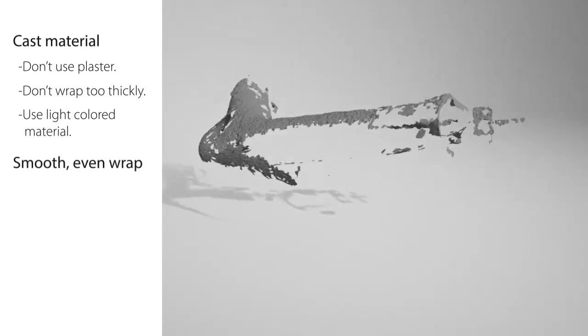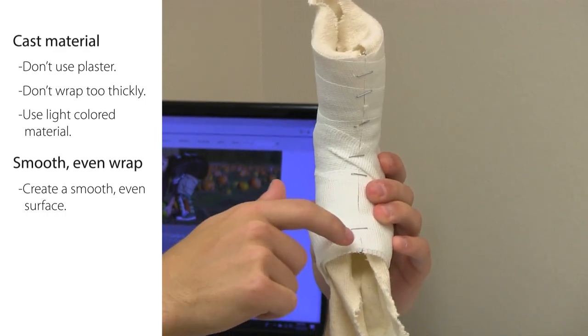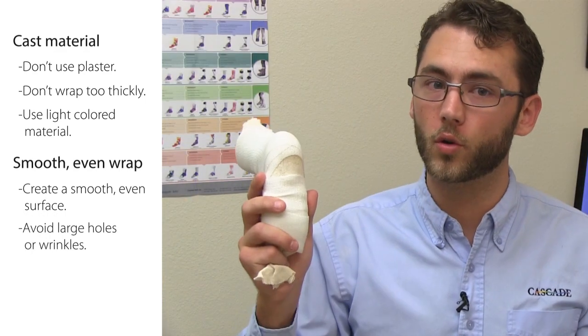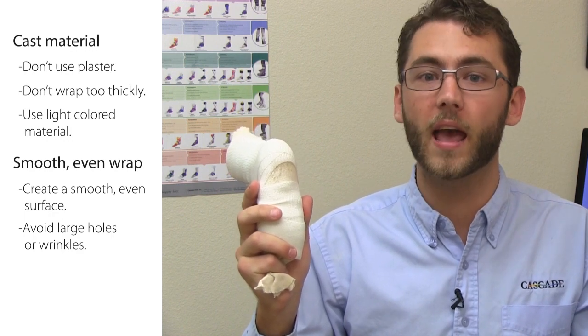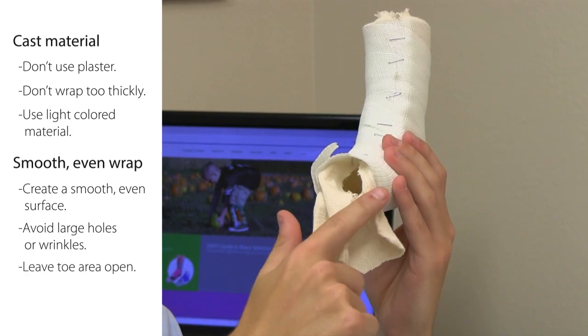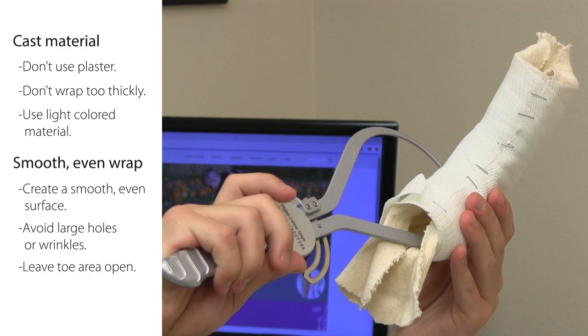Smooth even wrap: create a smooth, even surface. Avoid excess material sticking out. Avoid large holes or wrinkles because these create problems in the scan and can mask anatomy. Leave the toe area open so that calipers can be inserted to measure the thickness.